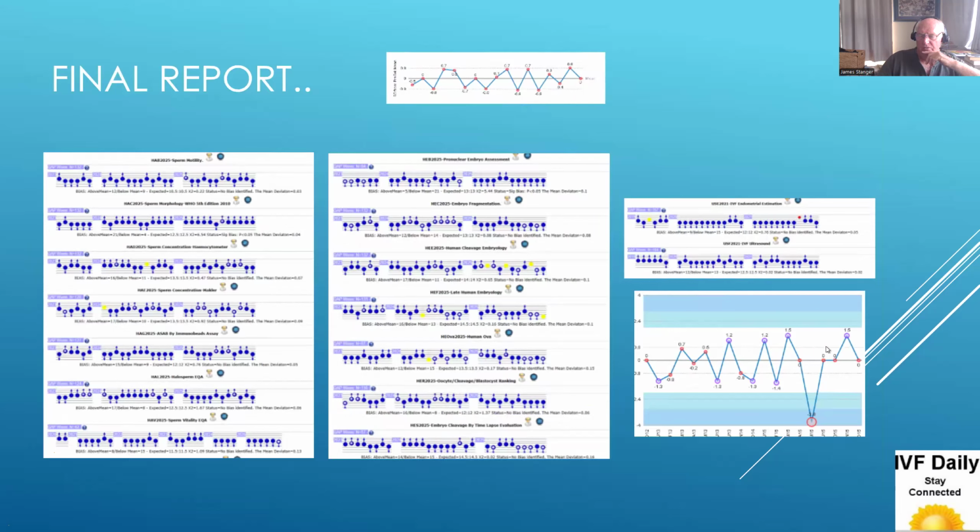I did have a lot of really good graphics on my site using Fusion graphics out of India, but they suddenly withdrew the right for running with ASP, so I no longer have these facilities. But I was able to graph these data very well. In reality, I've added this because this is a Levey-Jennings plot, putting standard deviations from the mean, one standard deviation, 2, 3 standard deviations. And I've tried to do this in a calculated way. This is my own programming to generate the same sort of graph as you would expect to see in a Levey-Jennings plot.